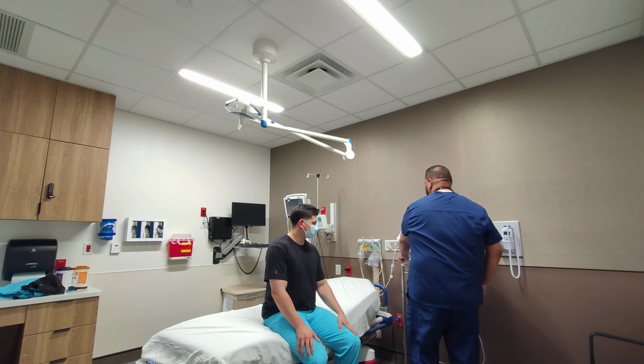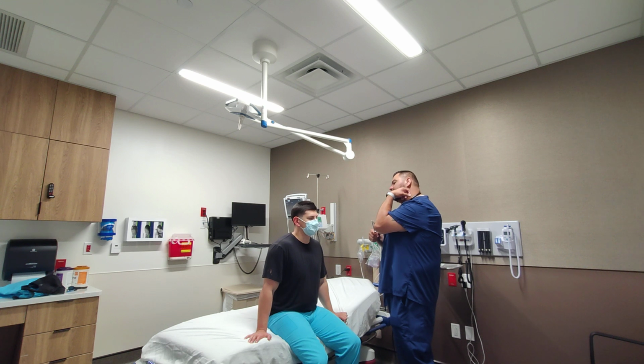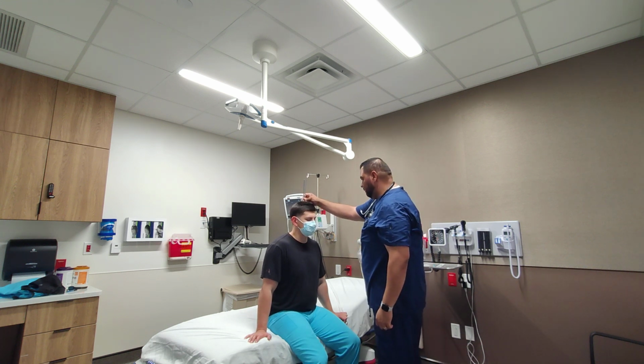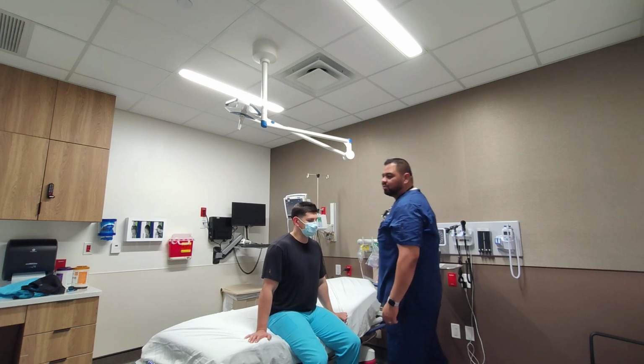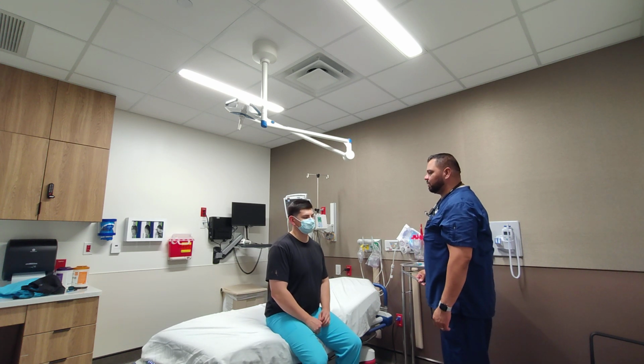Weber test, we're going to check for lateralization in his ears. Okay, so what I'm going to do is hit this, put it in the middle of your head, and you tell me if you feel it. Perfect. No lateralization noted to his ears. We're going to move on to the Rinne test.